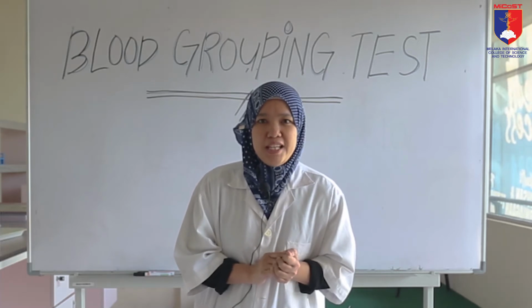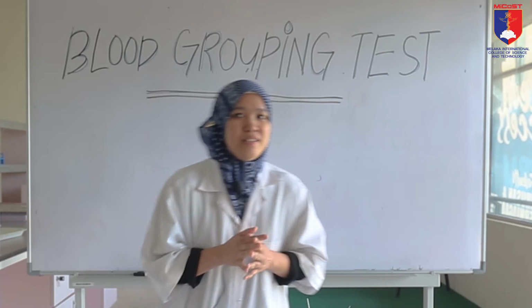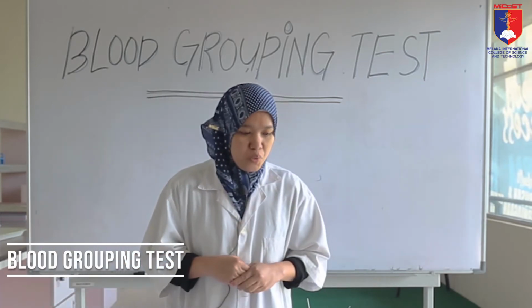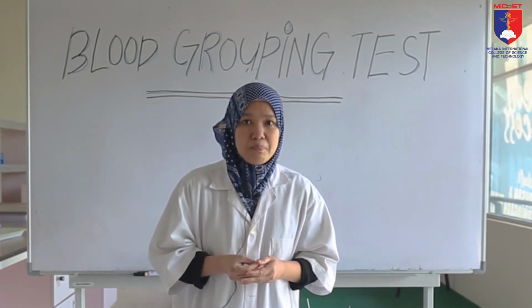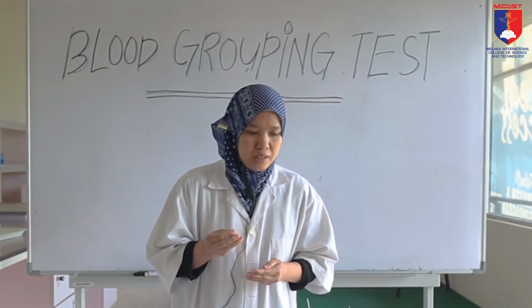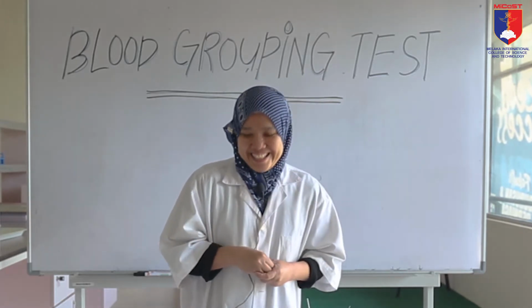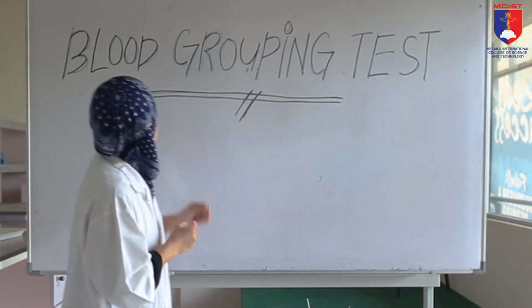Okay, so today we will be doing a test about blood grouping. Before we continue with this test, I will explain the principle behind this test: ABO blood grouping.